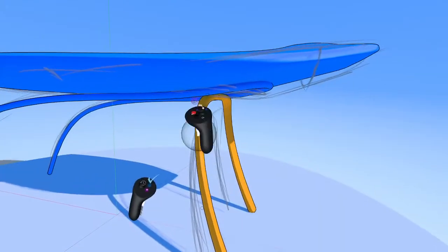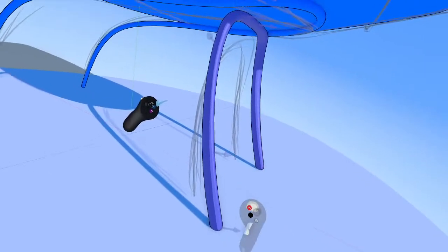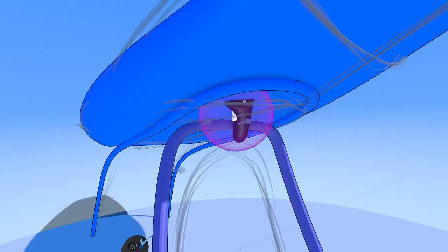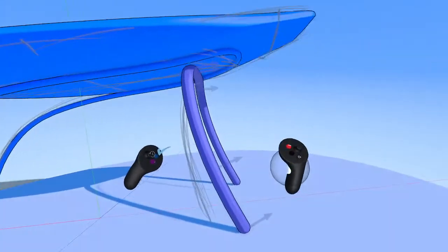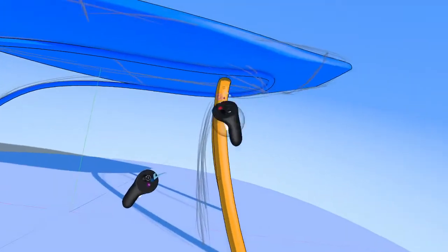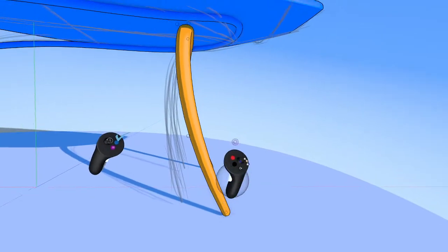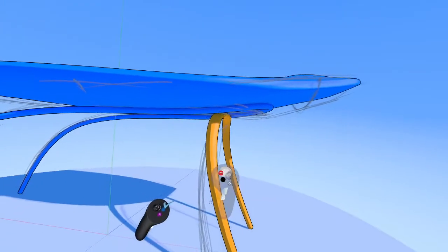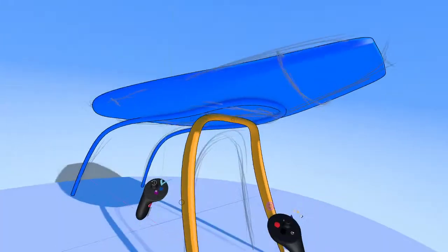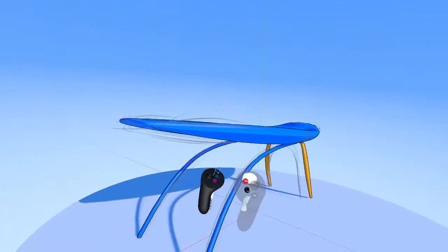And so we can actually change that and adjust it by flicking right on the joystick here, and then we get these arrows here. These are the normals, and we can shape that even further, like this. And flick back the other way to shut it off, and then we can actually taper this line as well by grabbing edit points and going left and right on the joystick. So we can get some pretty interesting shapes without having to model anything. This is just the stroke tool, and we're adjusting things as we go.